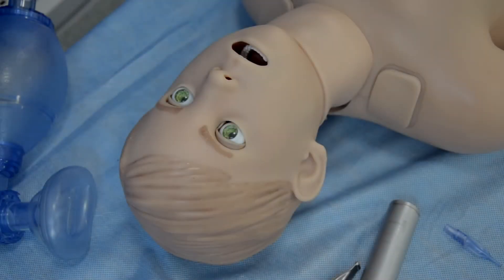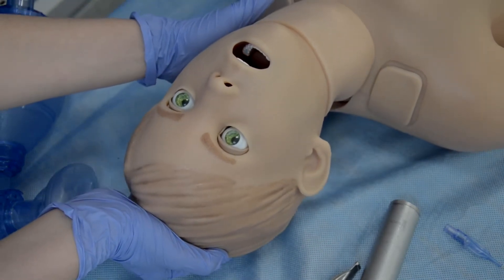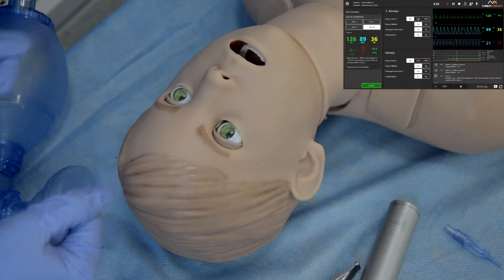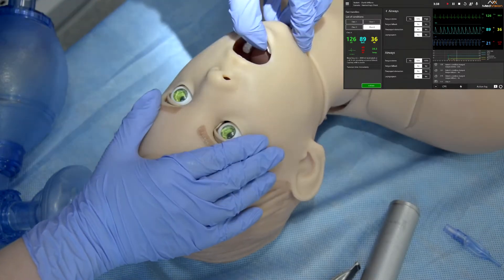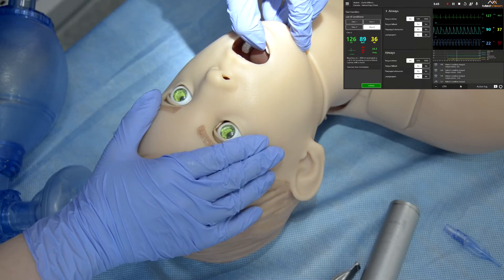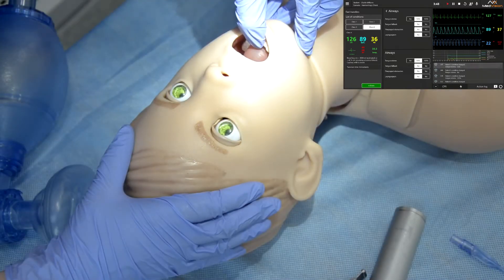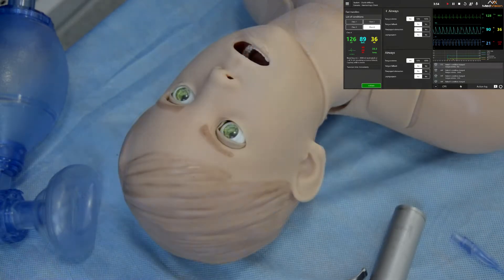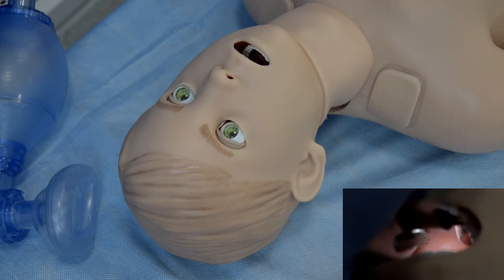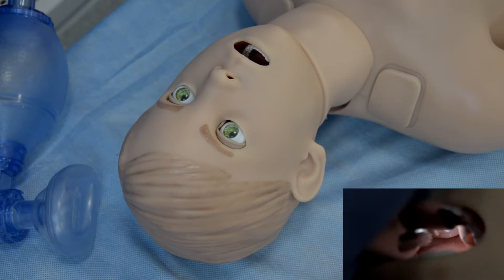Arthur has realistic airways supporting all airway maneuvers, so you can perform head tilt, chin lift, and jaw thrust. The airway anatomy repeats the anatomy of a real human, and you can see a soft and inflatable tongue. Arthur can imitate tongue edema, adjustable to either 50% or 100%. It can also imitate tongue fallback, pharyngeal obstruction, and laryngospasm.